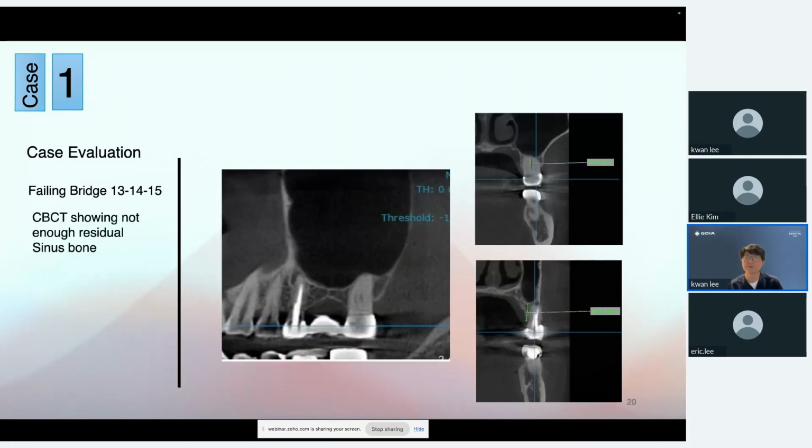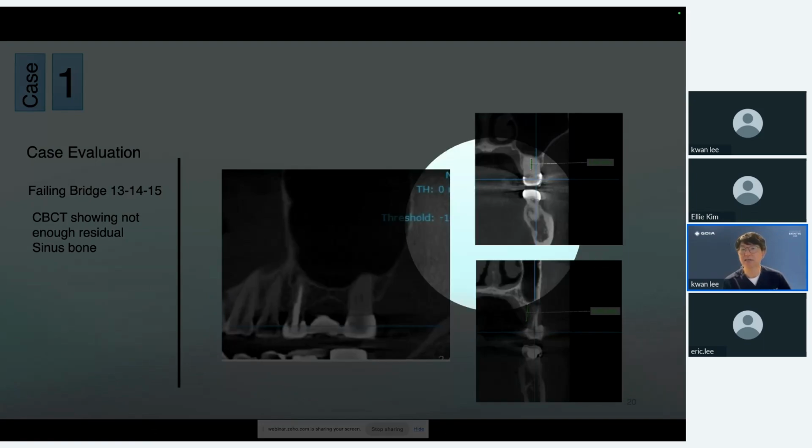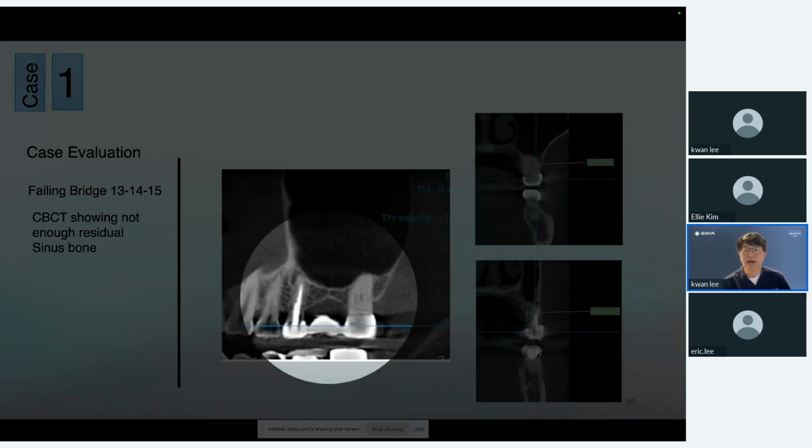So now we want to design your surgery. You want to do your homework before doing any type of surgery. So you get the CBCT, and looking at it, okay, there's my extraction site, but I don't have that much residual bone height. Look at that.